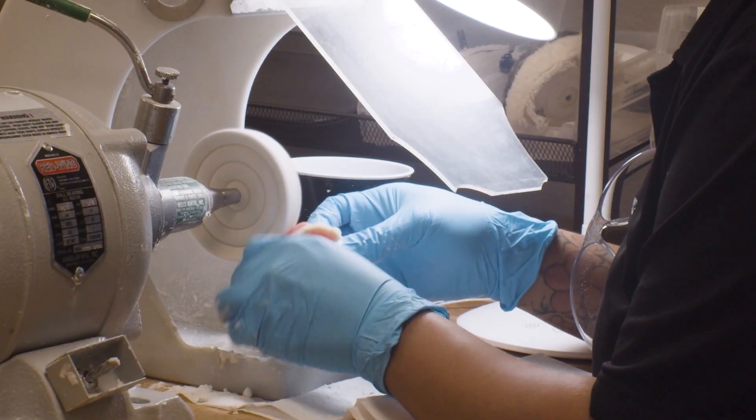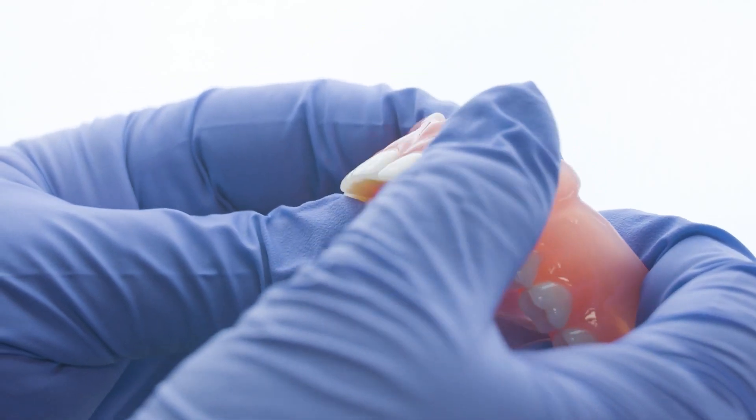Once cured, the denture is simply polished and finished before being sent out to the client.